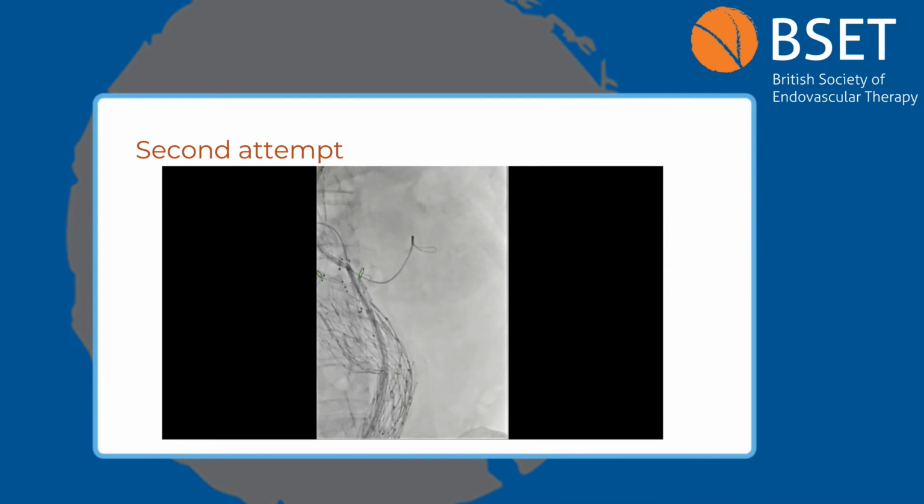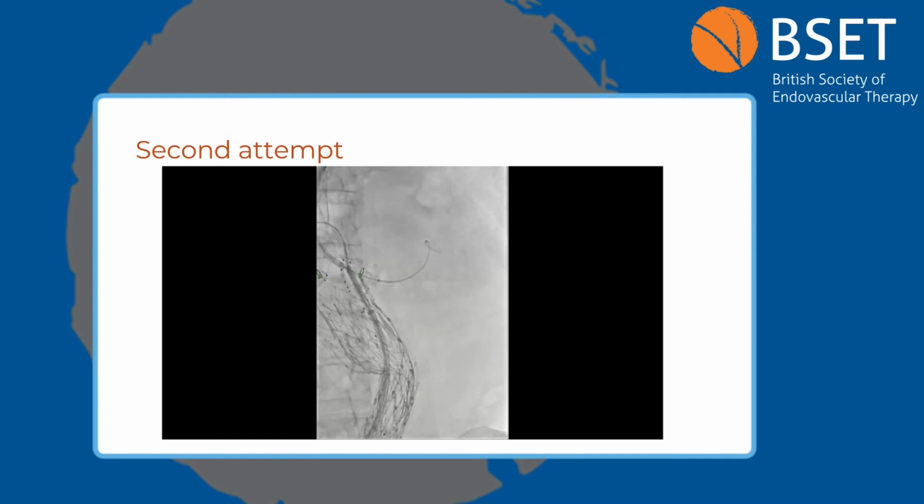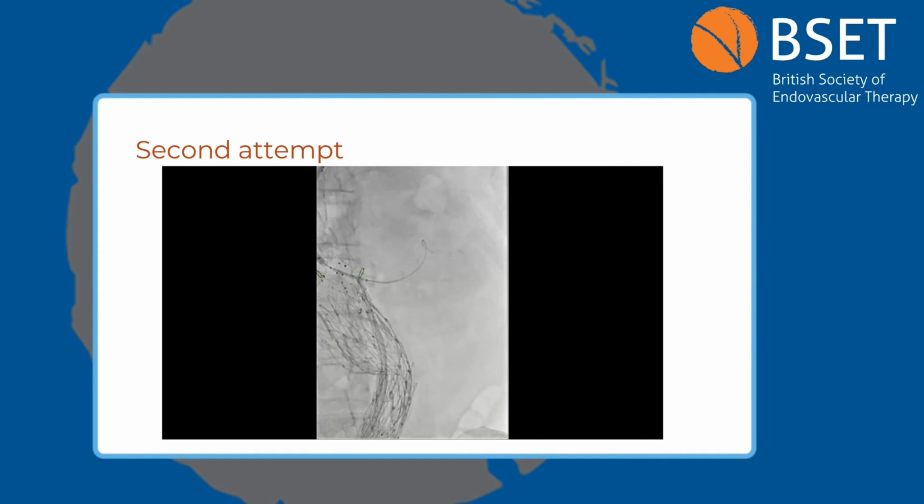And eventually we got a catheter. Now I have a more stable system. I don't like Amplatzer wires, but on a case like this, unfortunately, we need it. This is unfortunately also a relatively short length stent, but remember in the United States, we only have the iCAST, which is up to 22 millimeters for 6-French. So I had to build the stent to the fenestration and then eventually reinforce that.